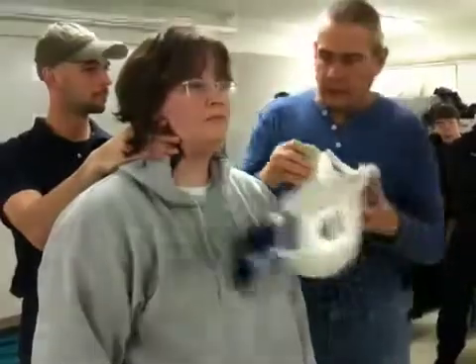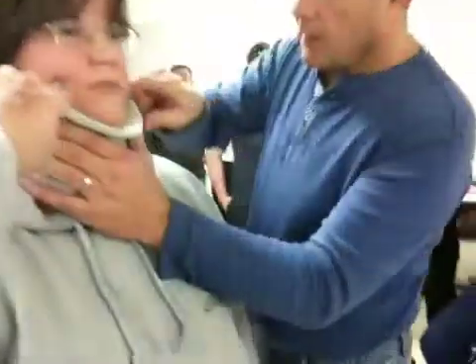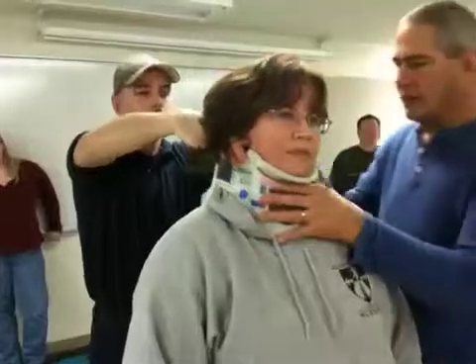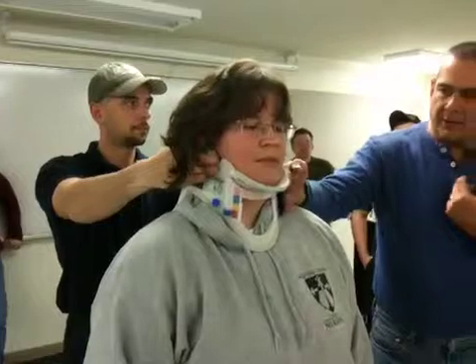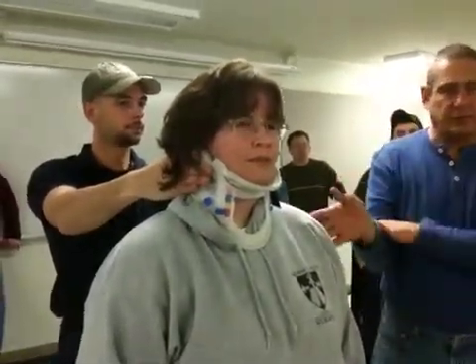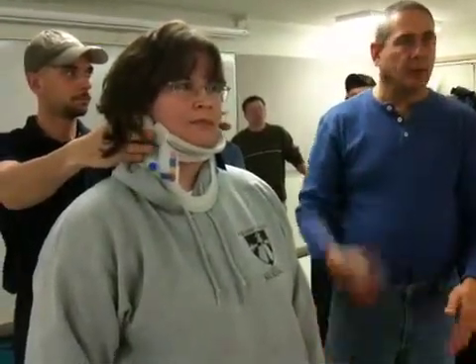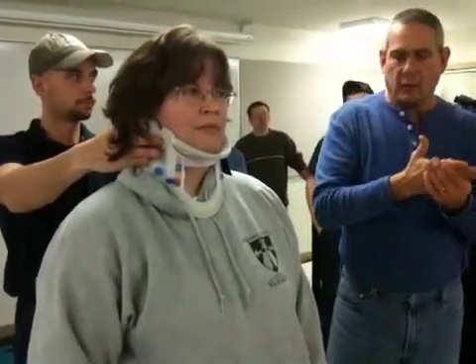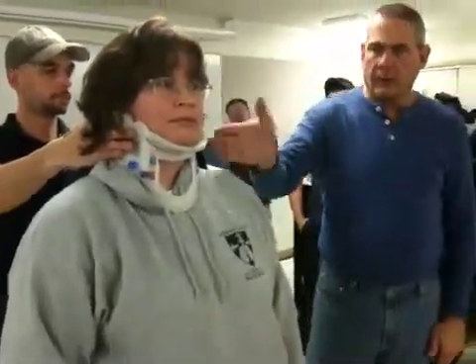So put the chin in place, roll your hands up. And see how this just naturally fits. Now she's got clothing on, so it's going to be a little awkward. But see, I didn't move her neck any one way or the other with a proper measurement. So if you have to go to court and they say, Ms. Weeks, how did you choose the proper size cervical collar? Well, according to the DOT National Curriculum EMT textbook, from the clavicle to the bottom of the mandible, that's what you use. 4 fingers, 5 fingers, or whatever. For taller people, I have to stretch it out. Shorter people, that's about as short as it'll go. It puts our heads in a neutral position.